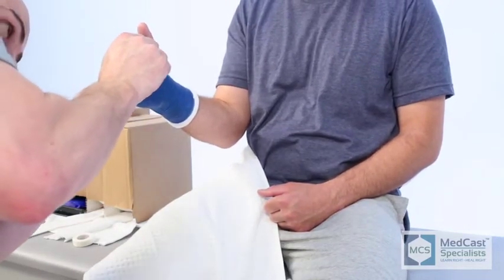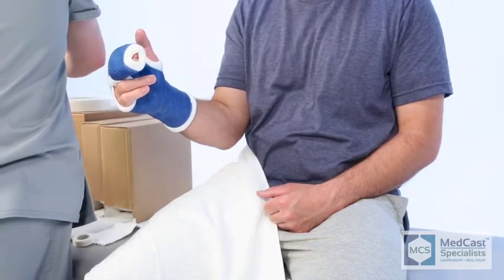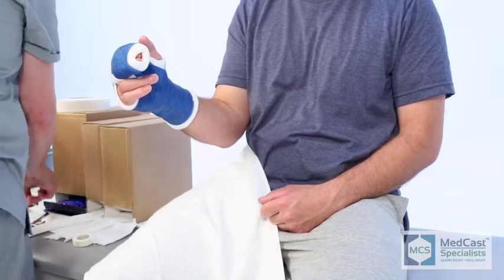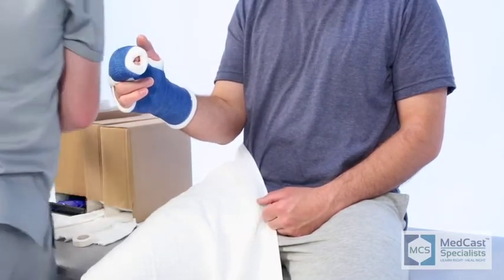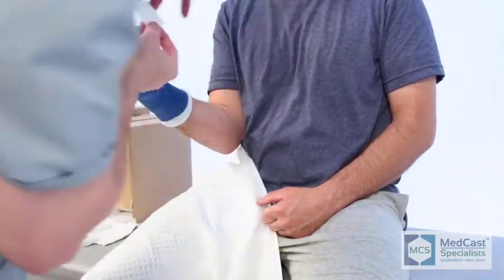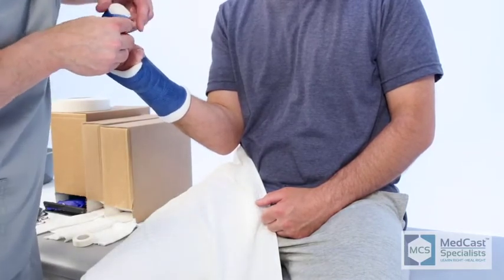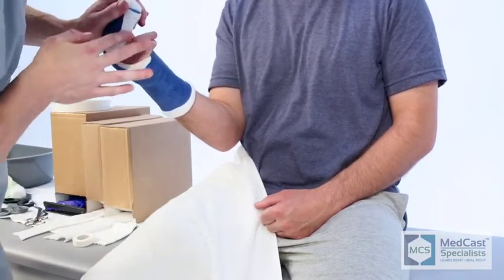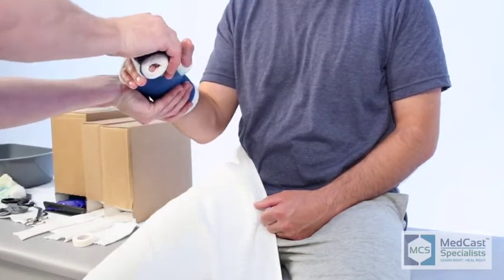And a technique that we're showing you here that we've found works very well is eliminating that sandpaper that's going to rub on their ring finger there. Sandpaper, of course, being the fiberglass, it gets pretty rough and pretty hard. So we've found some adhesive tape that we can cut a little crescent shape or a half moon shape out of on that first piece that we put in. That makes it slide right up into that web space. It adheres perfectly to the fiberglass, and then the next piece you want to measure to the appropriate length to come all the way out to the end of the third digit that's wrapped in the fiberglass. That gives it a lot more padding, so you're eliminating that abrasion to the ring finger.